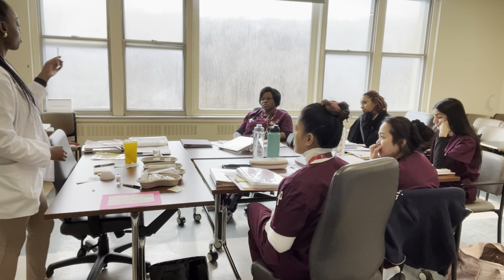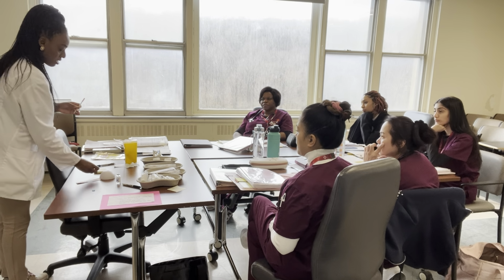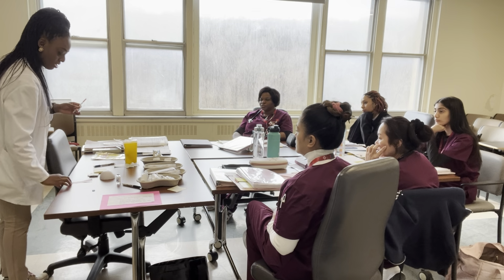Do you just go into the patient's room now with the alcohol swab? What am I missing? I'm missing the label.